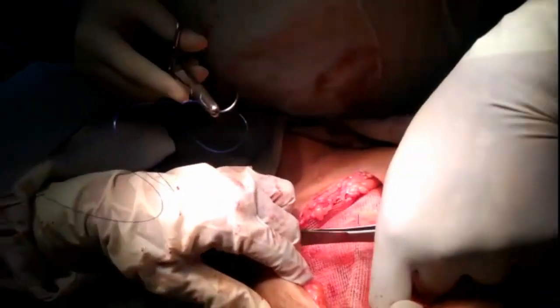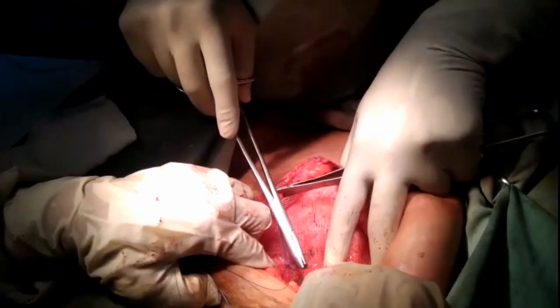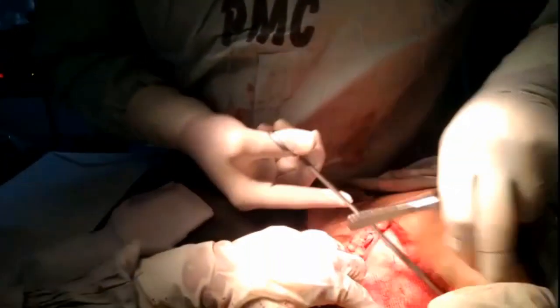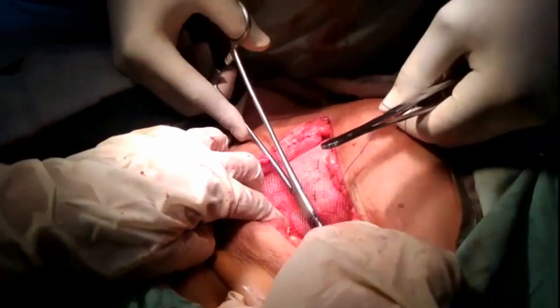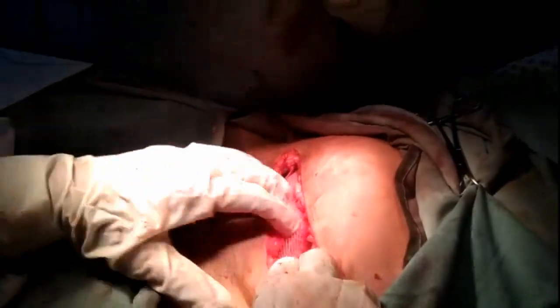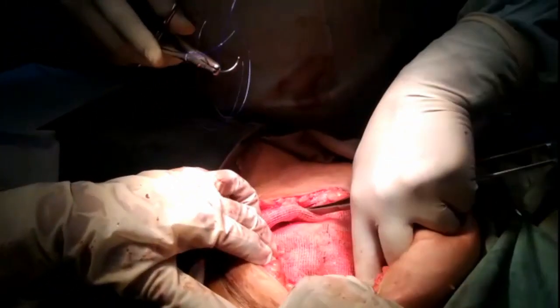Apply stitches from right to left and superior to inferior. While placing the mesh, there should not be any fold in the mesh. The mesh is lightweight and porous, and between the gaps there is ingrowth of tissue, which makes the mesh stable and gives an extra layer of strength to the defect.